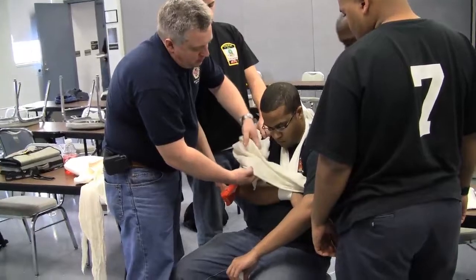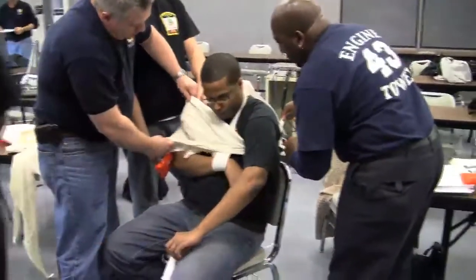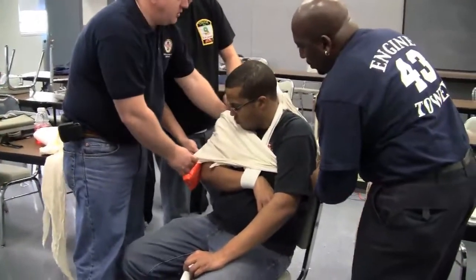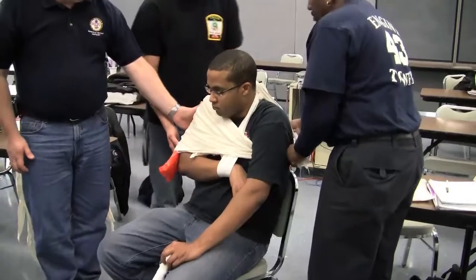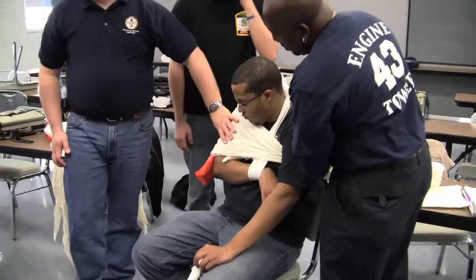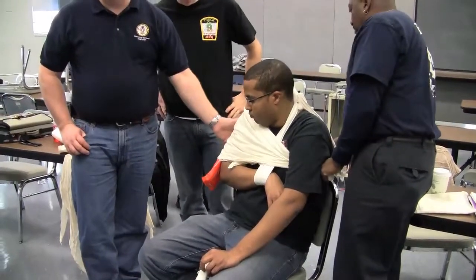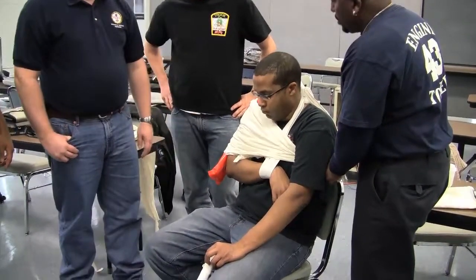This is wide as you can get it. This needs to cover — you're cinching this up back here, so that has to be wide, like that is what you want. See how this is covering this? You want that wide swathe covering your splint. Okay, then you need PMS checks.